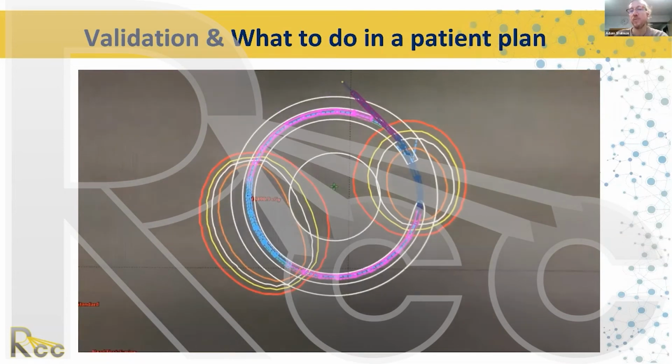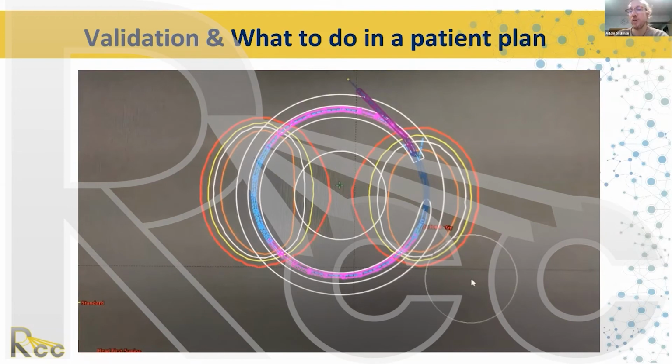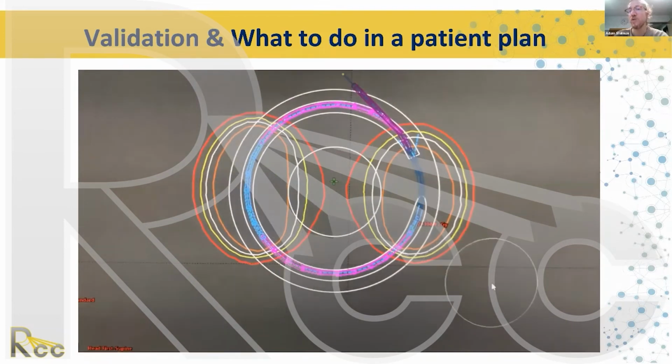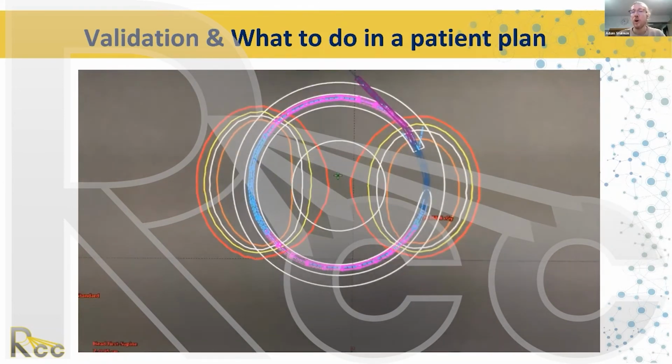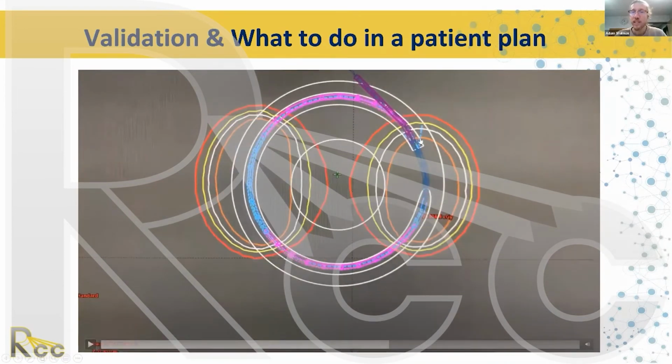And this is the dosimetry plan in TPS. It's a little bit complicated. That's why it's important to practice this and use autoradiographs. So one other option, I'm going to pause this briefly. So if instead of reconstructing here, looking at dose distribution in a patient on the TPS, and then shifting everything 5mm back and delivering that plan, you could reconstruct this tip 5mm further.